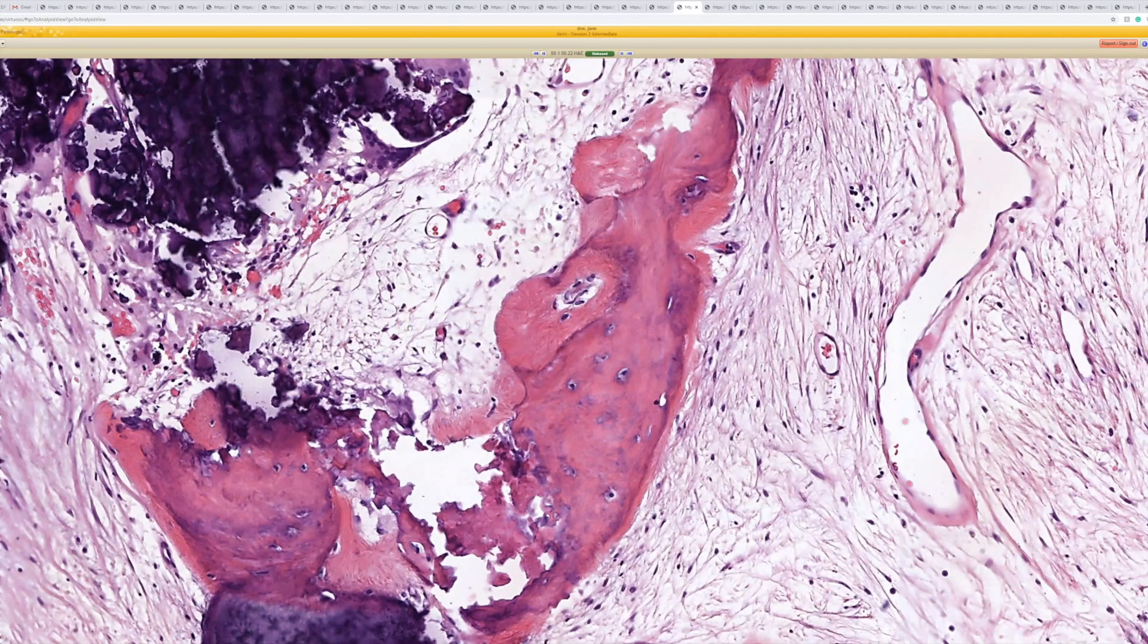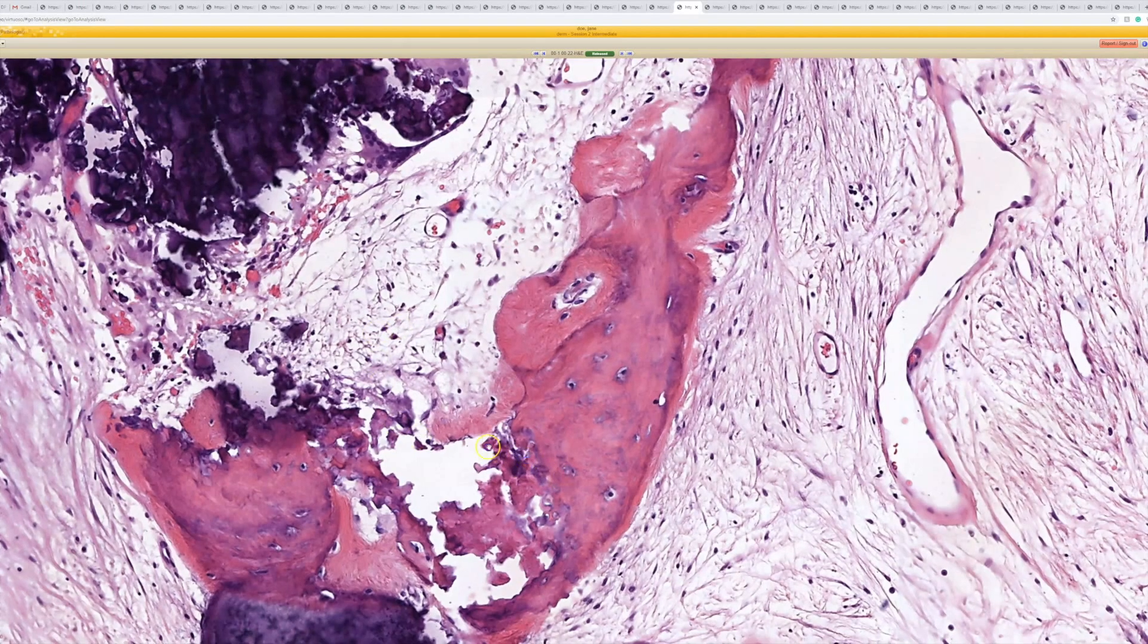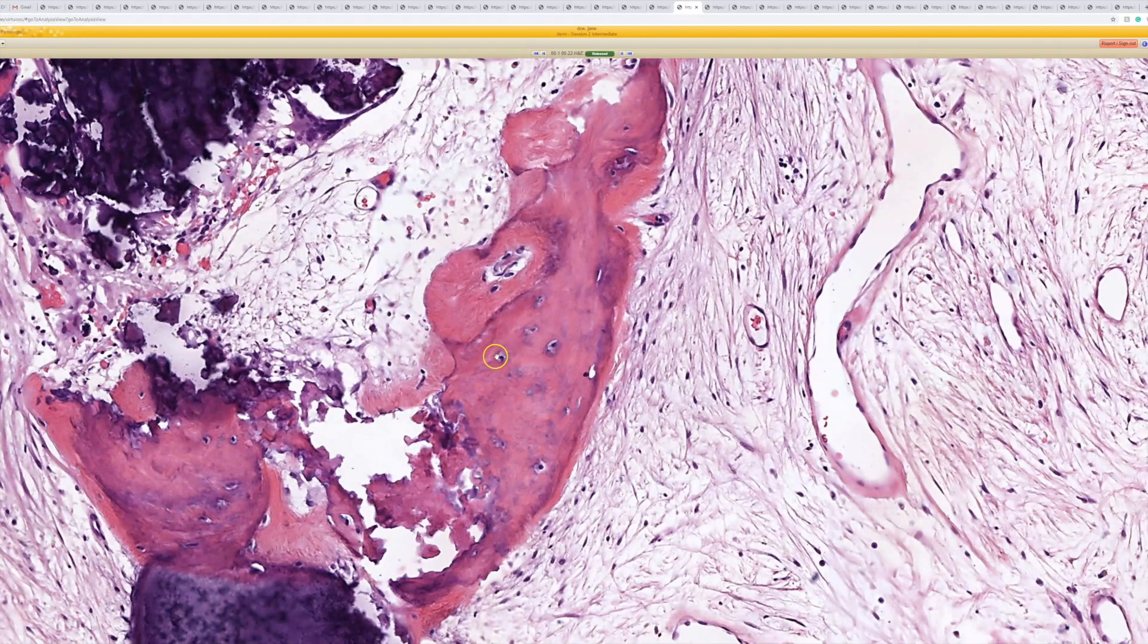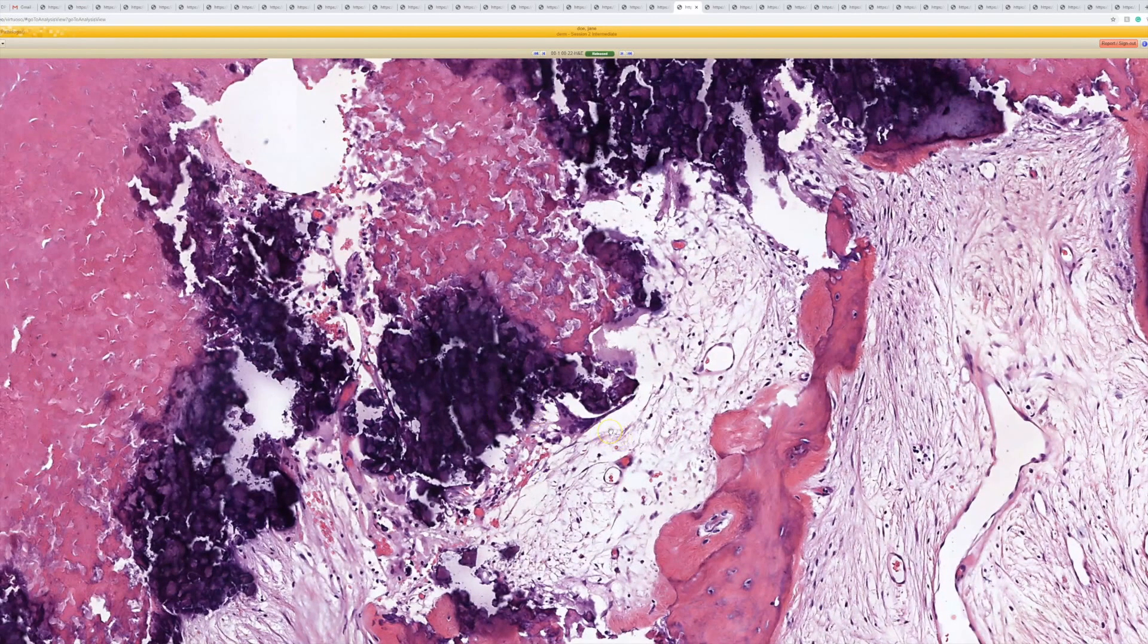Osteoid is type 1 collagen that gets calcium added on top of it and mineralized. But what you get is in actual bone, you'll have little lacunar spaces with osteocyte nuclei residing in them. So if you see the little space with a cell in the middle of it, that's how you tell it's actually bone, not just calcium.